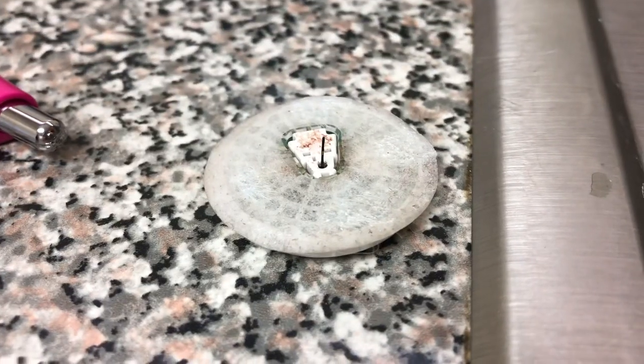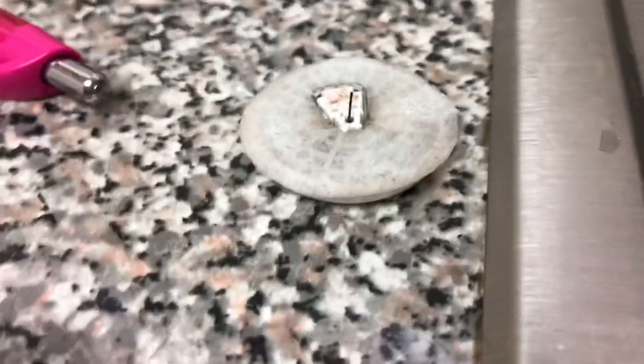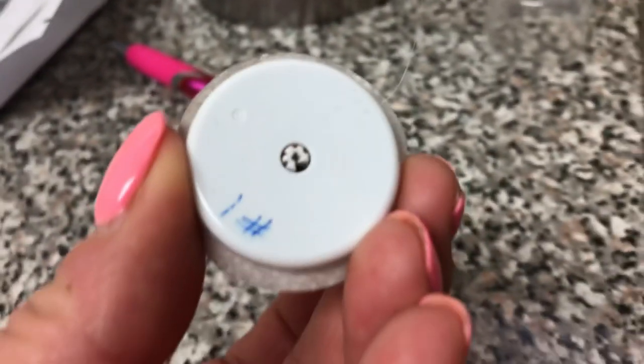Yeah, we'll show a spot on her. Which is like the old cartridge that looks like this that we just took off. So there's a really close-up picture of the little probe that goes through the skin to collect her blood, and this is what it looks like from the outside.